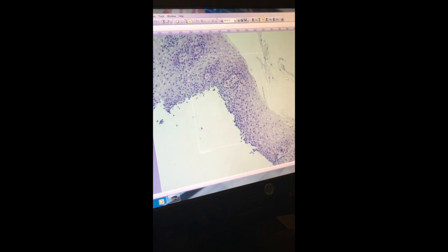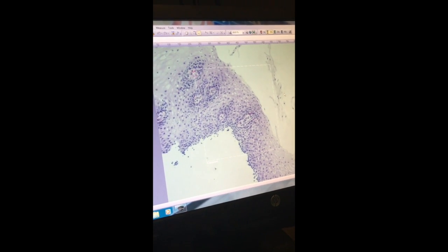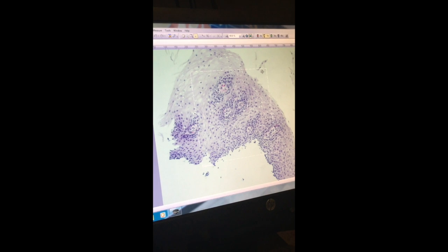Oh, there you go. What's with the weird yellowish red? Those again are what's called papillae, and they have the red blood cells in them. Ew. So those are normal. What's not normal is the pink that you see outside of it.